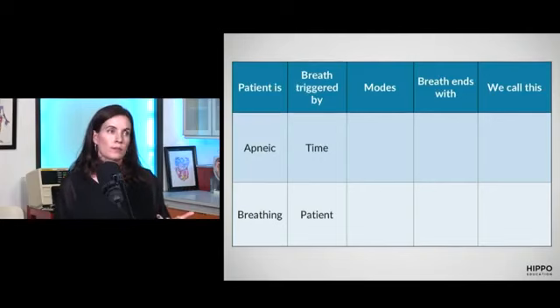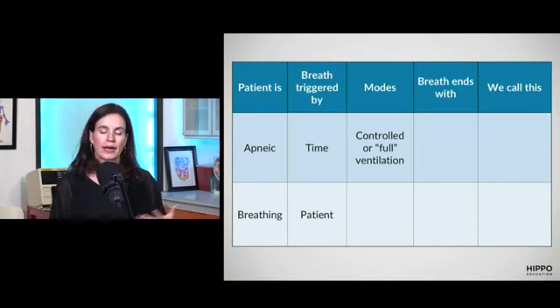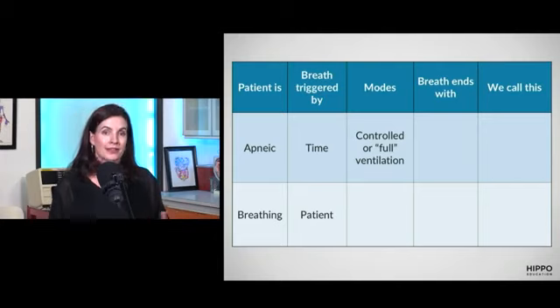Right. And that's our most common category, right? If we're most commonly doing rapid sequence induction or using paralytics when we're putting these tubes in, then generally we're going to be using this top row of information. Got it. And so we call these modes of ventilation different things. When people are apneic and they're on this time-based mode, we call this controlled ventilation or full ventilation. And part of how intensivists make this complicated is by having multiple terms for the same thing. But if your intensivist is asking you, is the patient fully vented? This is what they're asking. Are they on a controlled mode of ventilation? Or maybe they're even asking, is the patient apneic? And that's what they want to know.